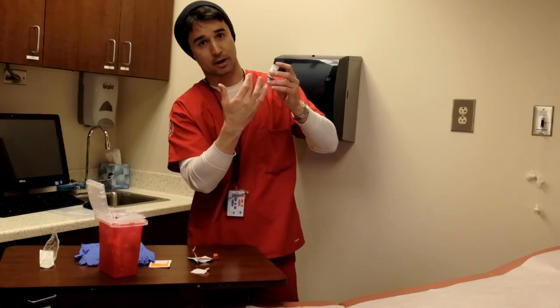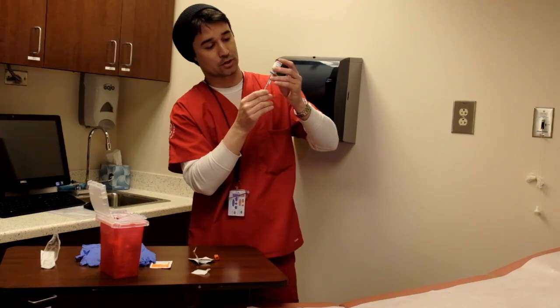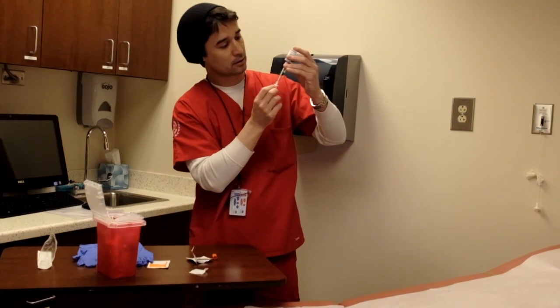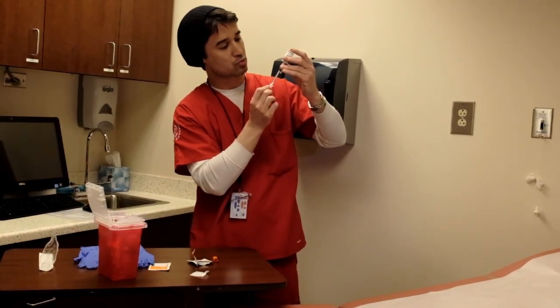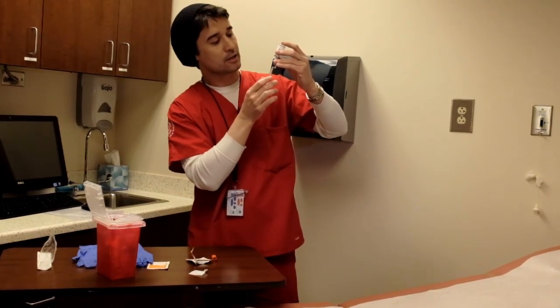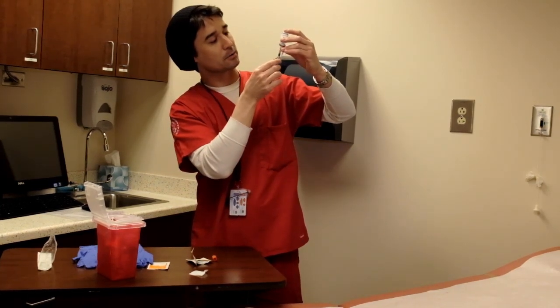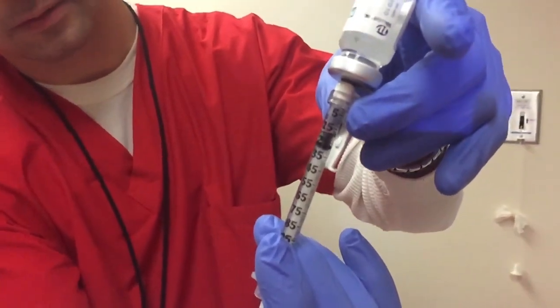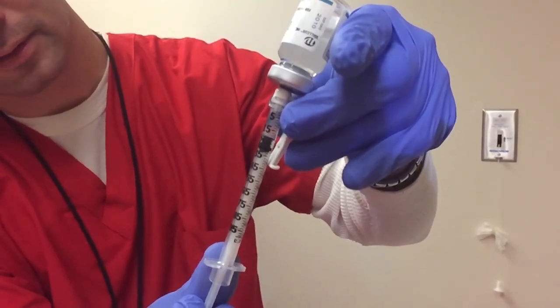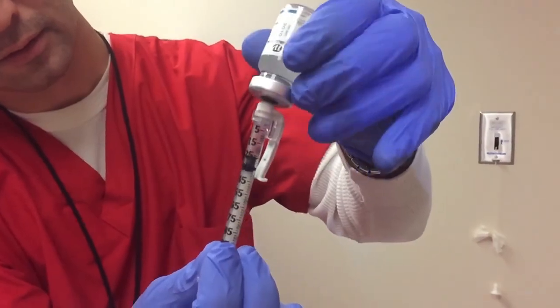What that's going to do is create a positive air pressure so that the medicine should flow easily back into the syringe. Now I wanted to get 20, right? So I'll pull the plunger back. Now I'm at 20. But I might want to go a little bit beyond that, say 25, so that if I have any air bubbles, I can push that medication back in there. You tip it a little bit, there might be some air bubbles, and now we'll push that back to 20. All those air bubbles should go back into the vial. And pull it out.